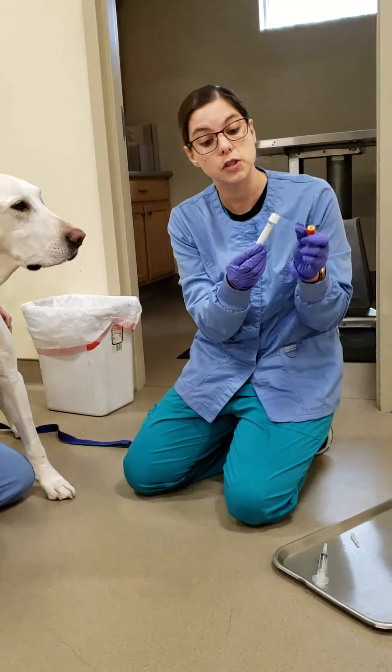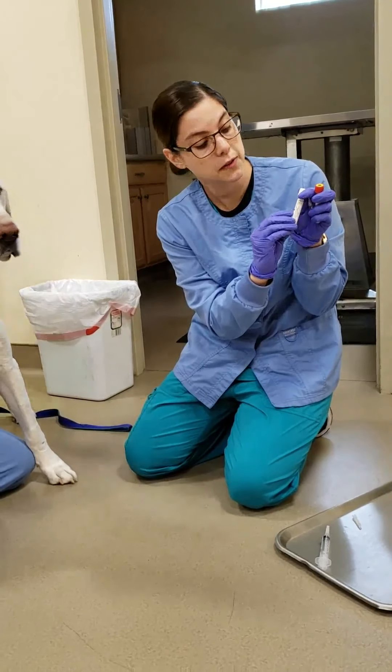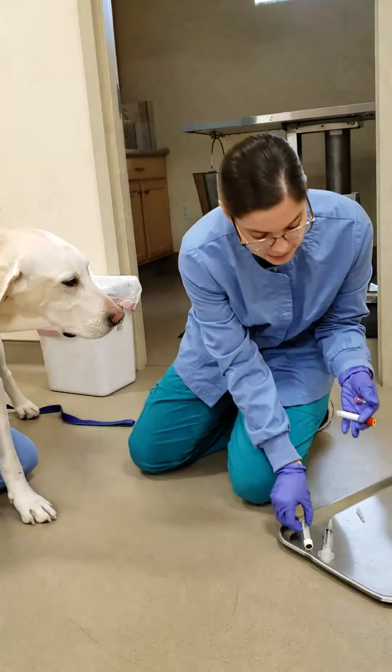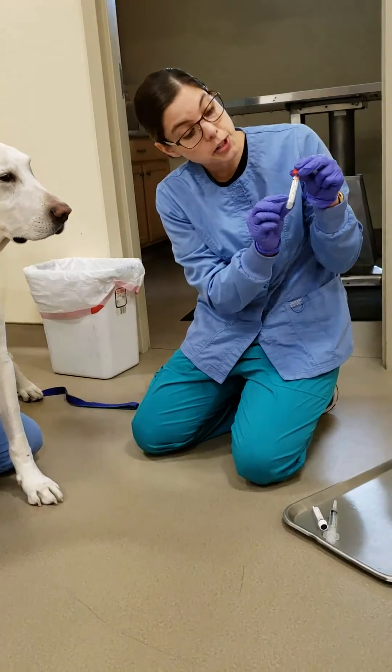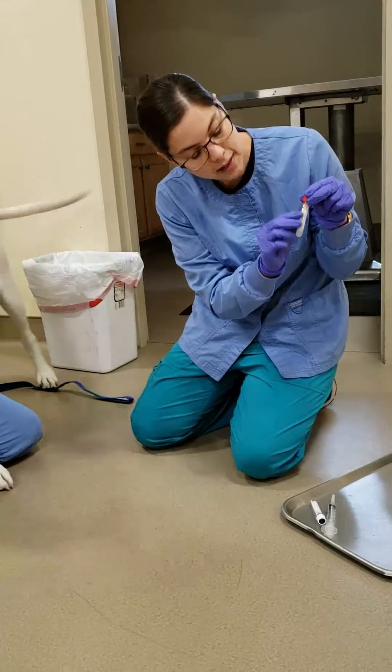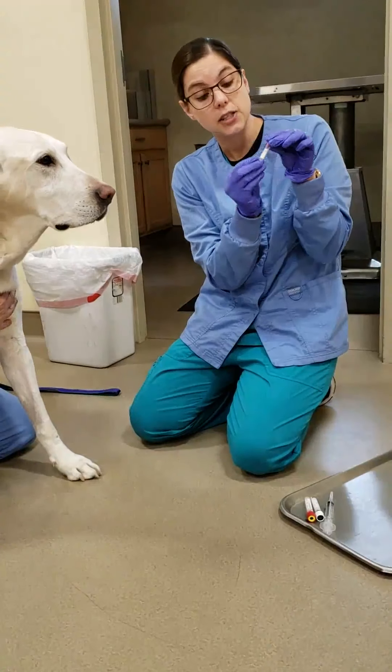We're going to start with our white non-additive tube. It has a little line there that shows you where it should be filled — we want to get to at least 90% of that line. Then we're going to do our red serum separator tube, which also has that line. Then last we would do our purple top EDTA tube, which again has a nice little line.